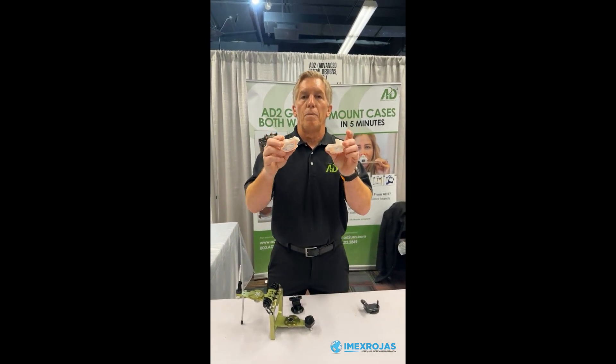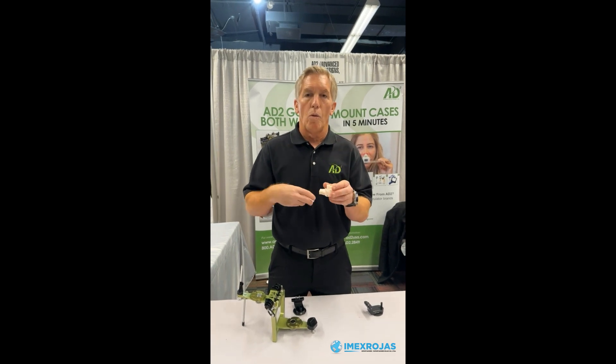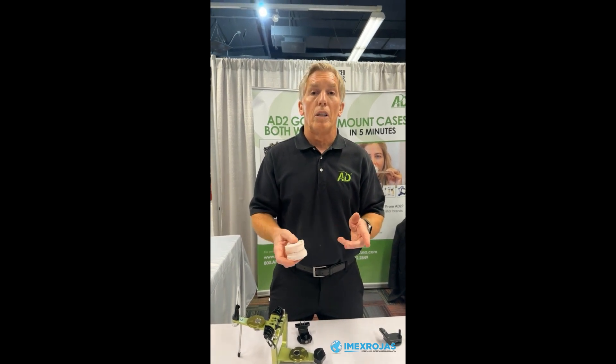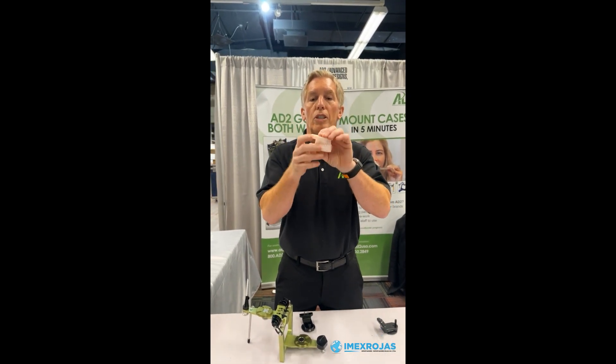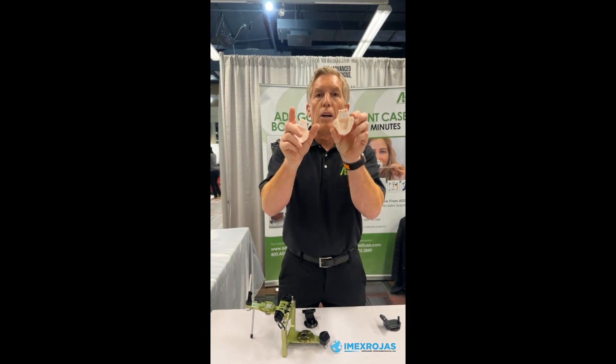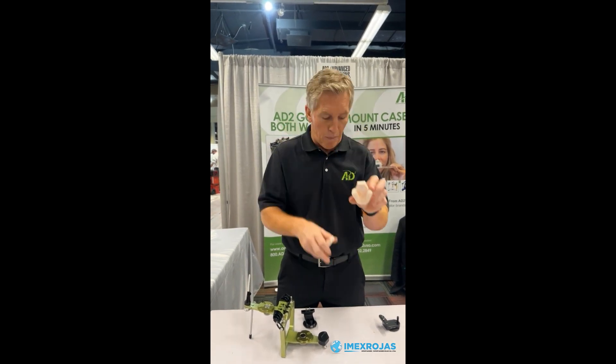These are some printed models that we've made. Both the upper and lower model were done in either Exocad or 3Shape. We have full design files available online that will show you how to set the printed height of the model at 30 millimeters, the anterior-posterior length at 72, and we also give you a download link that will provide the attachment file to go ahead and put on the back of the adapters.